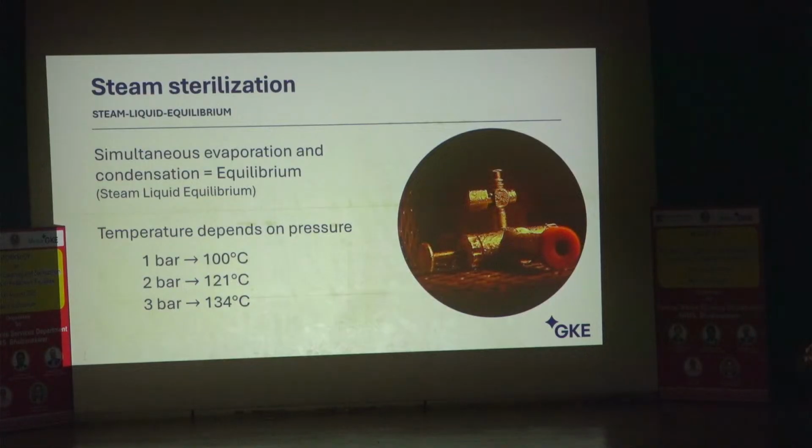But is it wet underneath this gasket? Is it wet inside of this valve? This is what we have to know. And this is what steam penetration is about. I have to know if the steam can penetrate to these positions, or here, inside the thread.